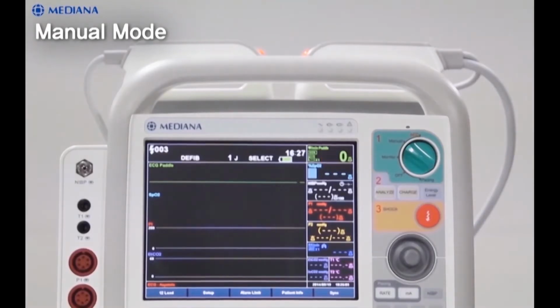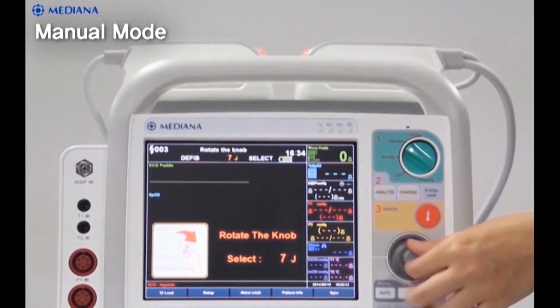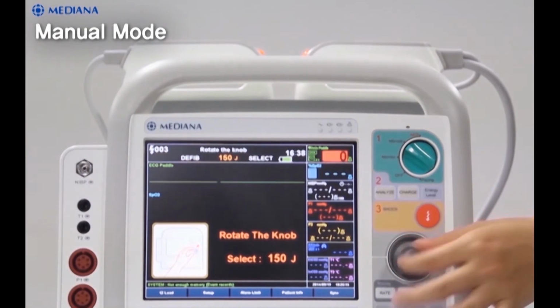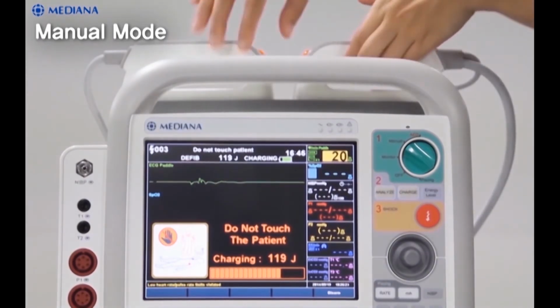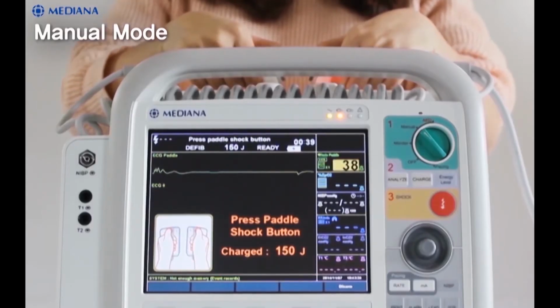To select the energy setting, press the Select Energy Level button and rotate the multifunction knob to the desired energy level. Energy choices range from 1 to 200 joules. To choose higher value than 200 joules, enter the service menu. And if you want to charge the energy, press the Charge button. There are 2 charge buttons on the paddle and the front panel.